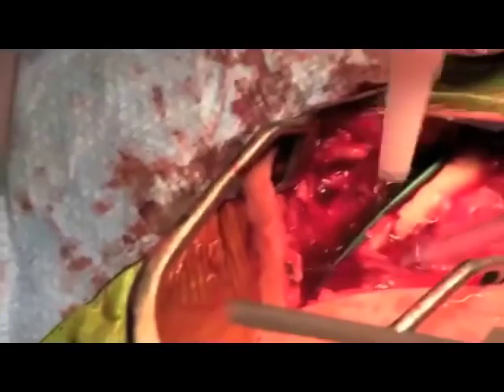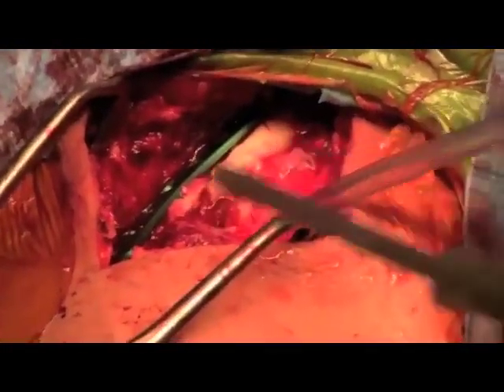The wound is copiously irrigated. Grafting may be performed in the case of bone loss. In this case, demineralized bone matrix is used to fill comminuted gaps.